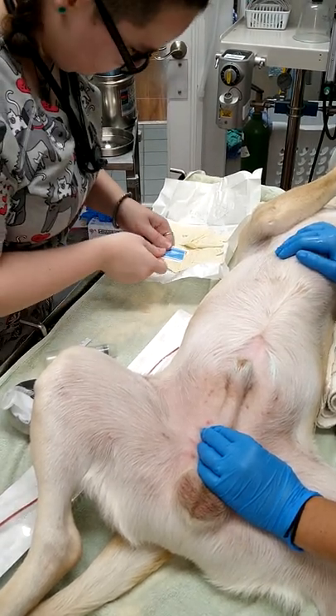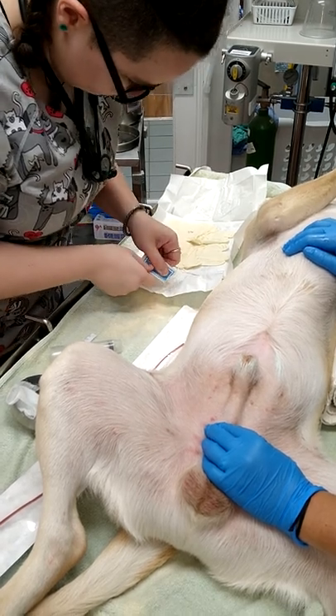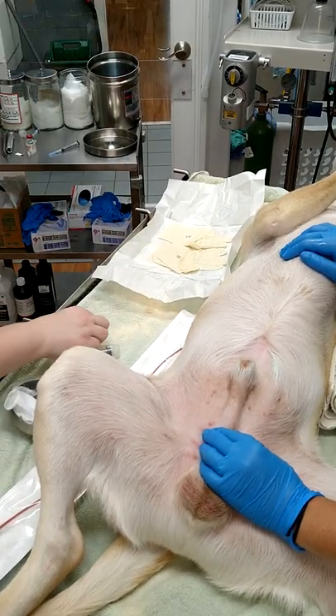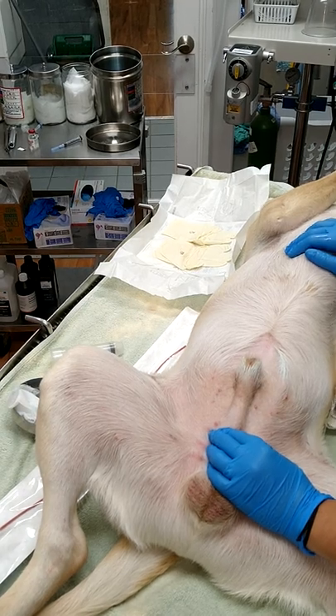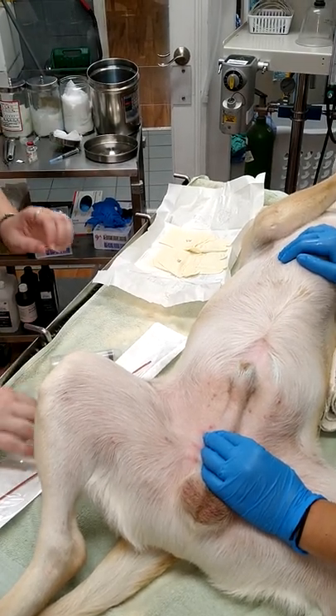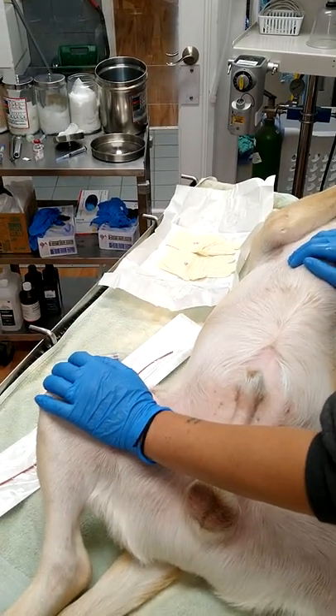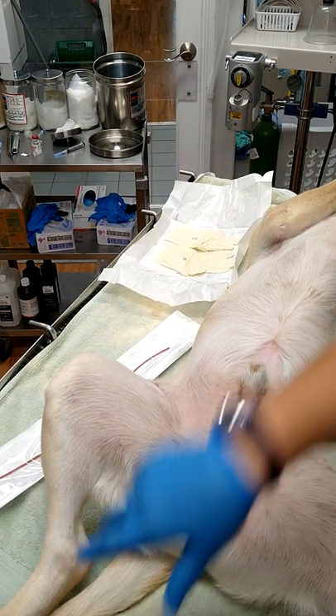You can just pop the top off and don't touch it. Pop the top off of it? Yep, and that way you can slide it out. Okay. I will open this for you once you get it in.